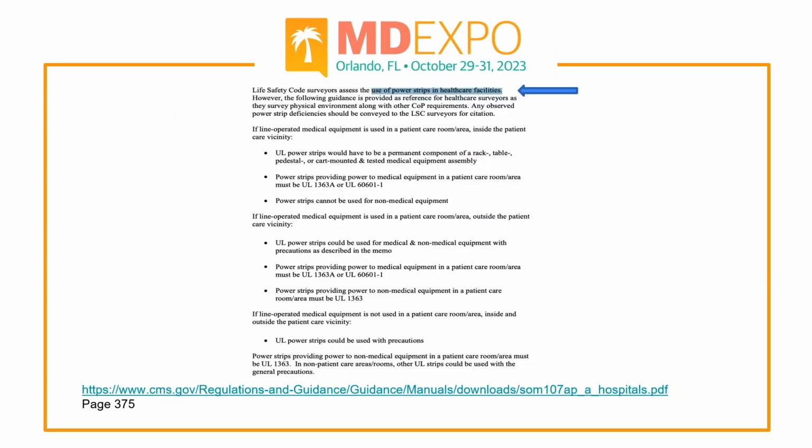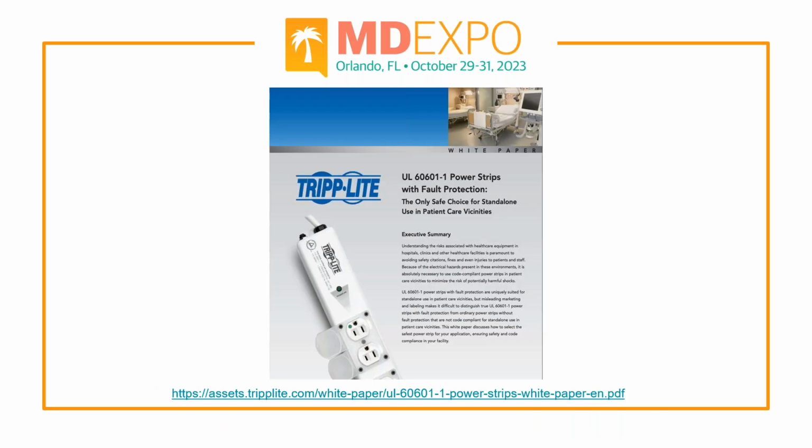Okay, so let's talk about the CMS regulations that we were talking about. Everybody knows about power strips. I don't want to open that can of worms here, but the Life Safety Code survey addresses the use of power strips in healthcare facilities, and this is the requirement that is spelled out in this document.